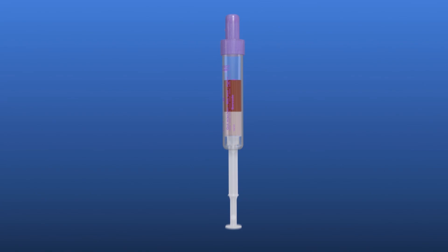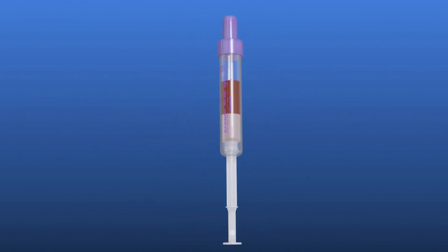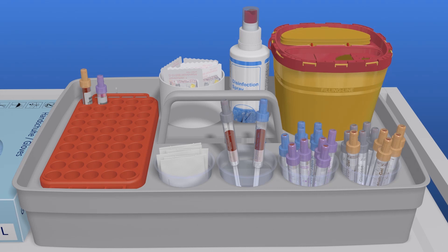To avoid the blood clotting, invert the S-Monovette several times. For all additional samples taken, pull the S-Monovette plunger all the way to the end until it audibly clicks into place, then break the plunger off. For the optimal coagulation of the S-Monovette serum after collection, store these standing upright.